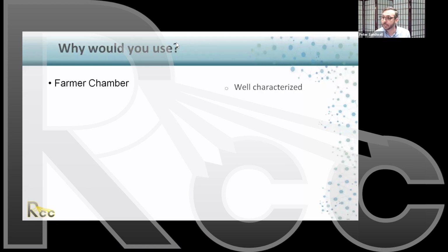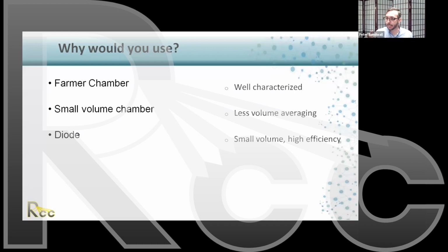There are different reasons, but the well-characterized, well-studied one is the one that I put up. I just want you guys to engage with the content and engage with me. I can't have conversations with all of you, but I can see your responses and I enjoy them. Small volume chamber. Why would you use a small volume chamber? Less volume averaging, definitely. What about a diode? Small volume, high efficiency. It's good. Okay. OSL or TLDs. Why would you use them?